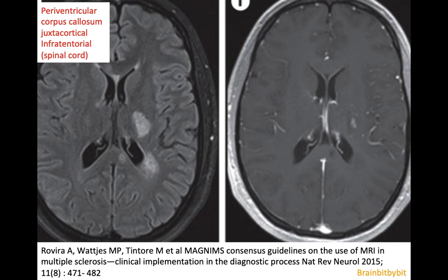The typical locations for multiple sclerosis are periventricular, corpus callosum, juxtacortical, infratentorial, and in the spinal cord. I'm not going to show spinal cord lesions because this is Brain Bit by Bit.